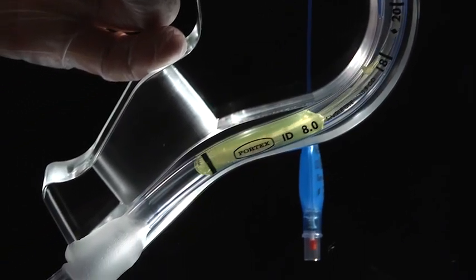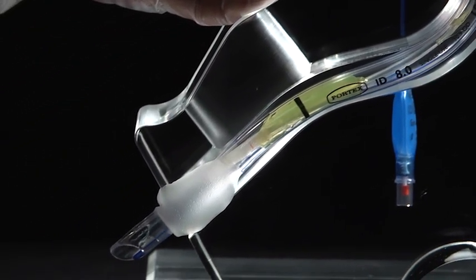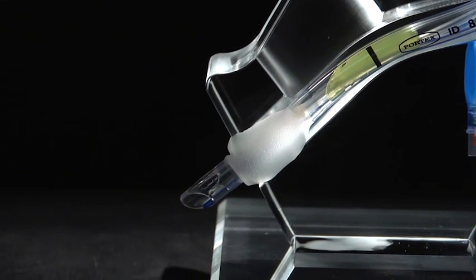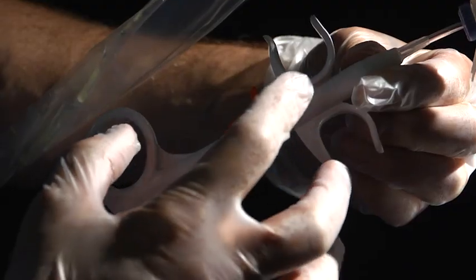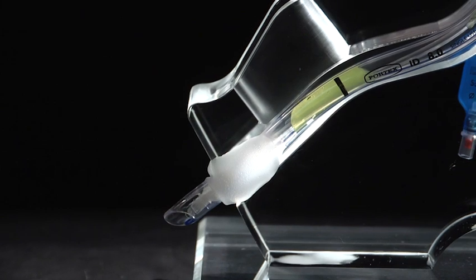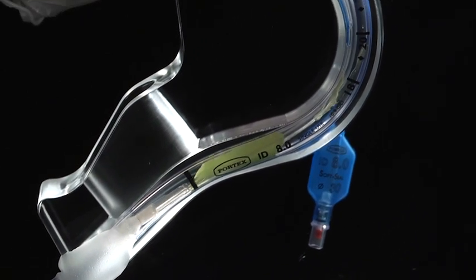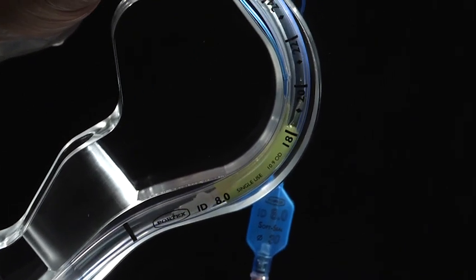Notice how the device passes through the mobile secretions and does not push them out the end of the endotracheal tube. The Endoclear device is deployed and pulled back into the BCA adapter, where contents can be disposed of or cultured.